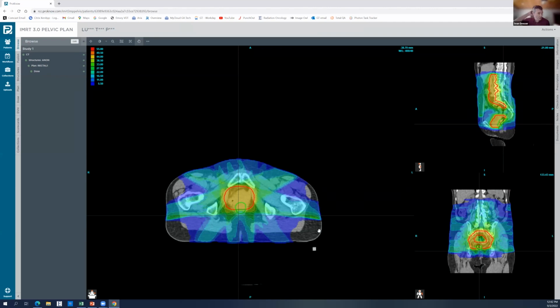Yeah, we do VMAT plans on our chest wall. Well, if you say chest wall, you're talking about intact breast or breast treatments, basically. Is that the question? Or is it chest wall lung? Because we don't typically do VMATs for chest walls like a breast treatment. We do tangential fields. We do compensator-based treatments, electronic compensator. But if you're talking about a lung or something like that, and you don't have gating, with ITVs, if you can do the full motion of your PTV or your GTV and then draw that in, then you get the range of motion that you're going to treat.